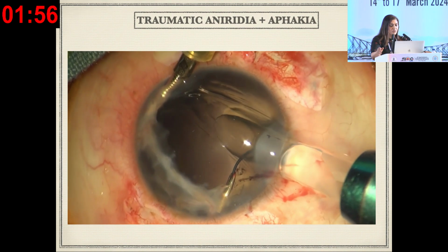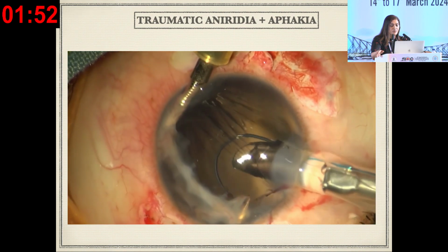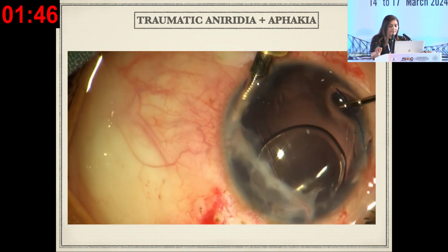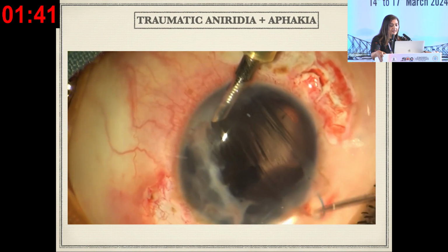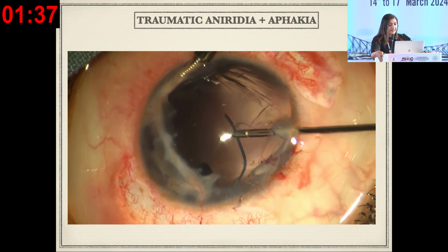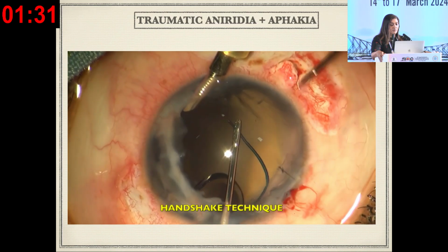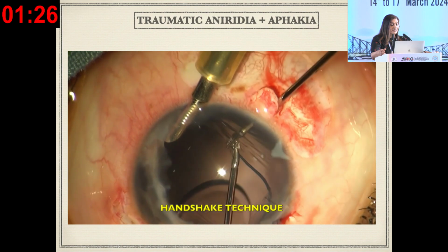all these surgical procedures. So now what I have decided is that I'm going to do a glued secondary IOL fixation for this patient, and I have taken up a 3-piece intraocular lens, and I'm holding the tip of the haptic and externalizing the leading haptic. And now this is the trailing haptic that goes back inside the eye, and then I transfer this haptic from my right hand to the left hand, because then I need to go from the right side sclerotomy side to the other side and hold the tip of this haptic to externalize it.